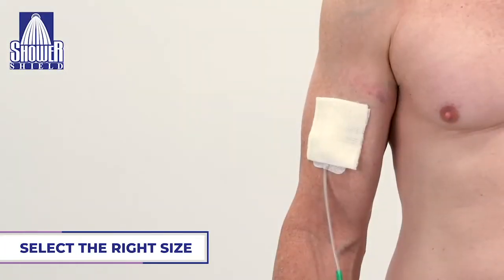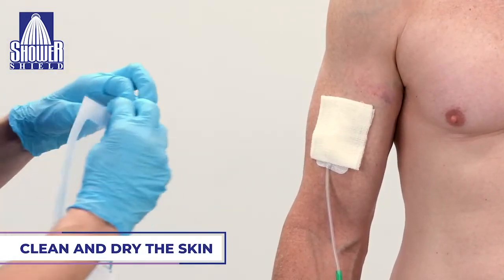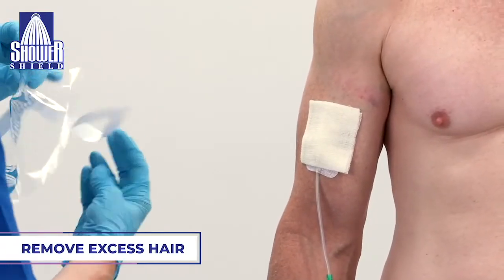I'm here today to show you how to properly apply Shower Shield. First, you want to select the right size of Shower Shield to cover and protect the site. You want to clean and dry the skin to remove all dampness and lotions or moisturizers. You also want to remove excess hair for a proper seal.